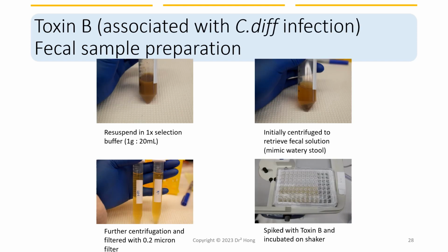Now, during my PhD study, I was involved in developing a proof-of-principle assay to detect Clostridium difficile toxin B in human fecal samples. Now, the brown liquid is the real sample. And the chubby hand behind it was me wearing extra small-sized gloves because we happened to run out of the correct size that day. Now, this work was published as part of my PhD dissertation, and needless to say, the experiments were gross.